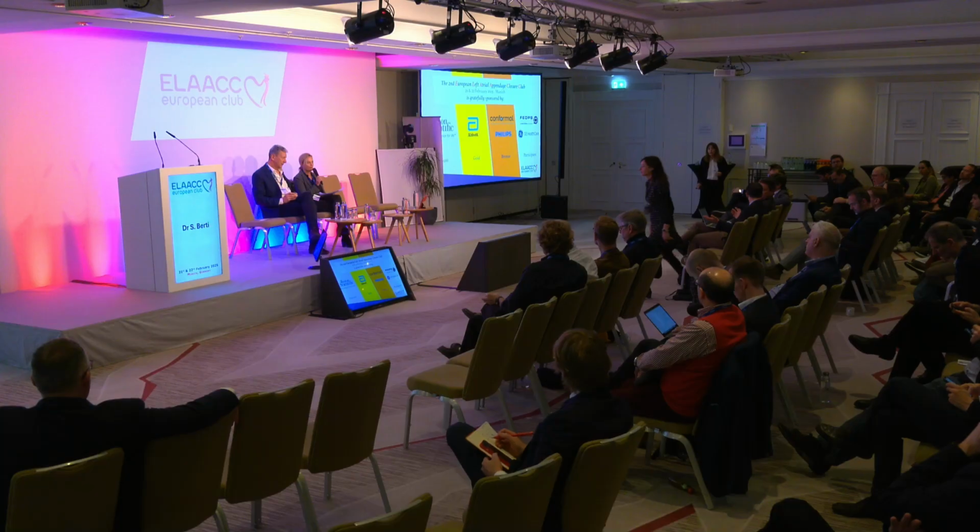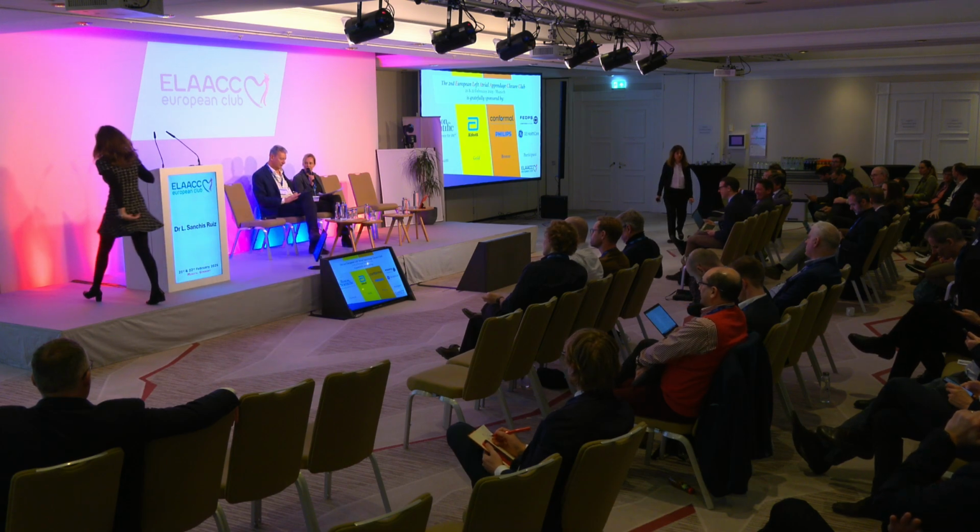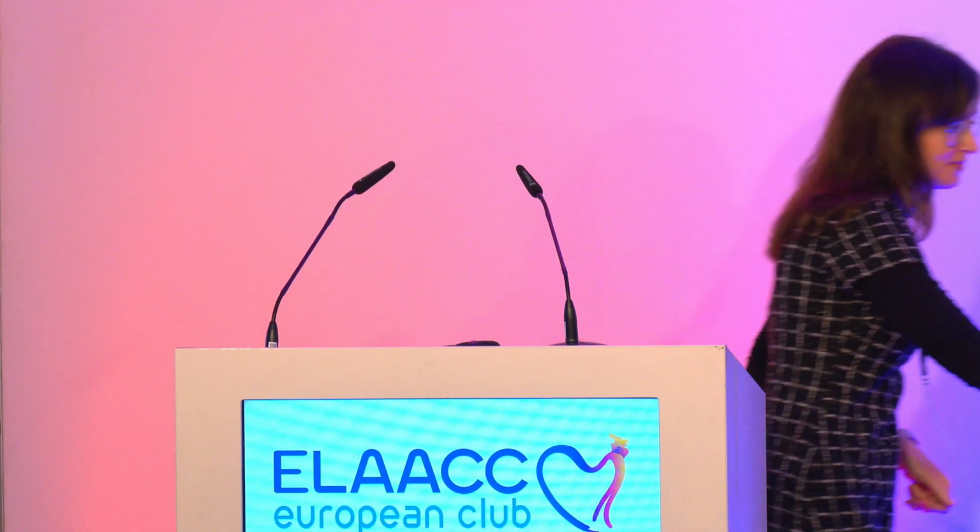Is somebody doing the procedure completely TEE guided? Sometimes? Okay. Yeah, so let's go into the subject. And Laura, you have a lot of experience with the mini TEE, so you can give us some advice on how we could use it during the procedures. And you can point out maybe a little bit what the differences are if you compare it to a normal TEE probe?